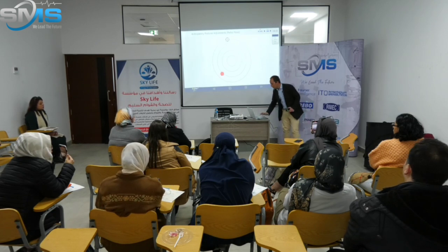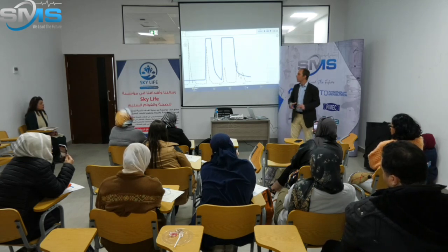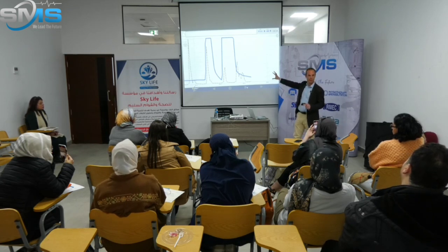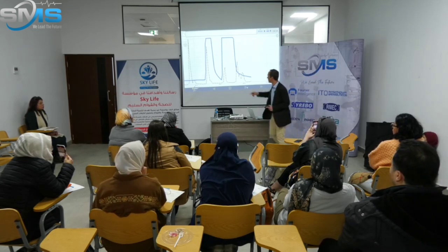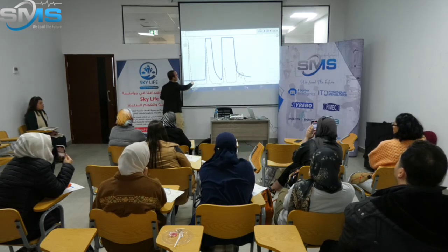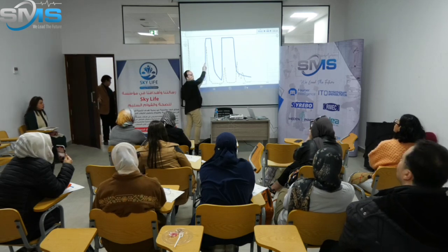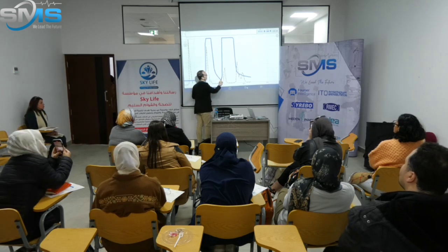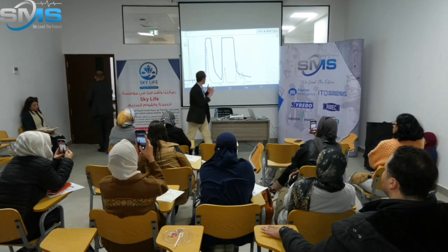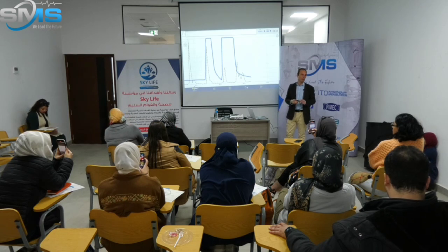So this is to make sure that the reflex is back, because you can check afterwards. You don't see the contraction during the exercise, but you can see it afterwards. Here I see the dashed line. When I move here, I moved without contraction, so that's bad. But here I moved, and we can see that just before I had a contraction with the blue line. Here again, I moved just before I had this contraction. And that's how you can make sure that the reflex is back correctly. And this reflex is the core of good continence.